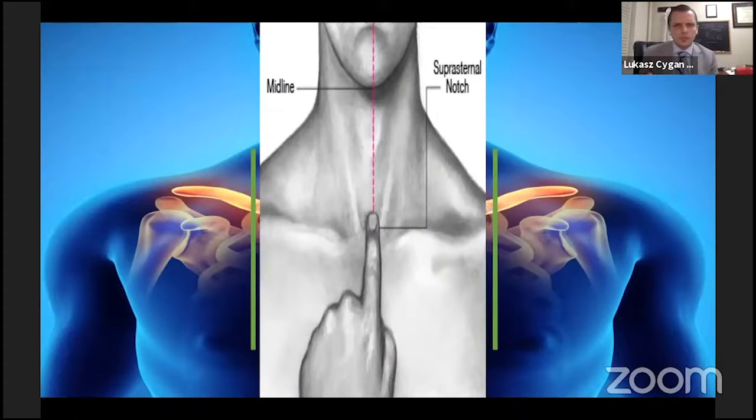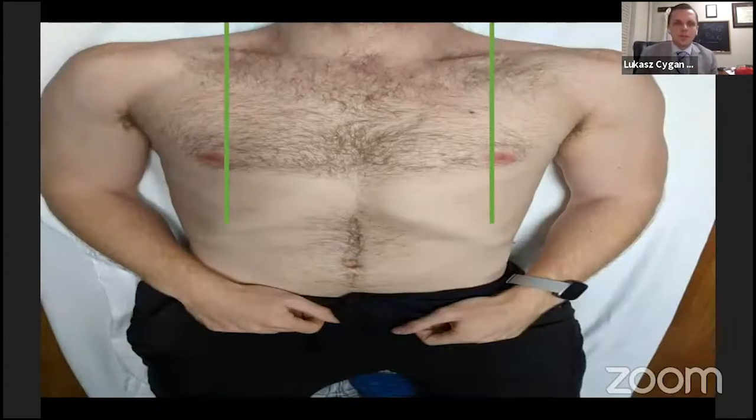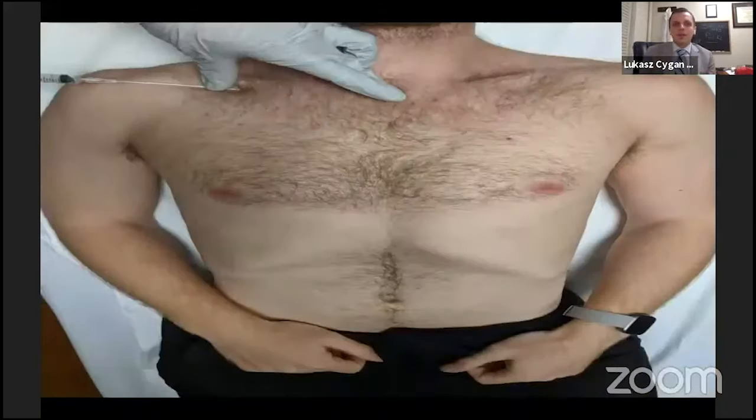Now, most of you should know this, but sometimes we're not going to get flashback. So on to my first tip. I'm going to move on to our real life patient. Another disclaimer, no residents were harmed in taking any of these pictures. But you'll see our midclavicular line there. Put the needle just lateral to it. You see my index finger is pointed towards the suprasternal notch. That's my target. I'm going to go in that area.